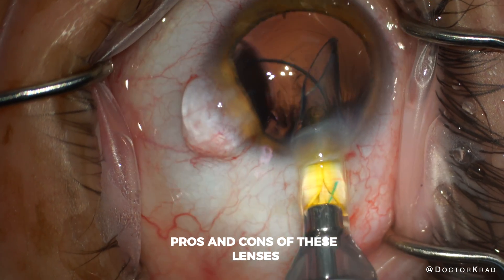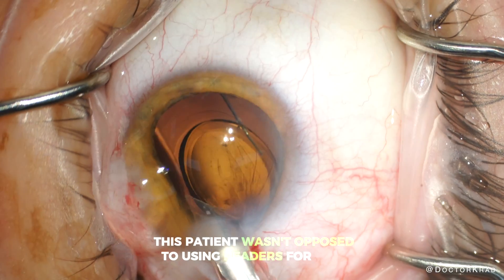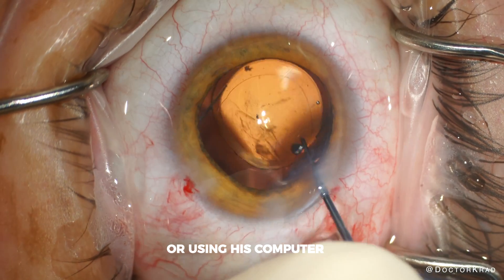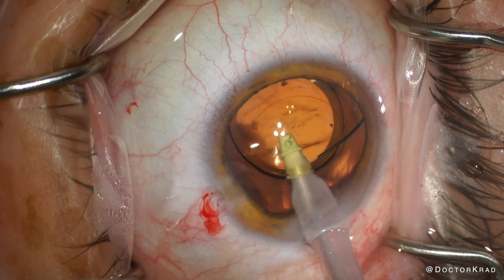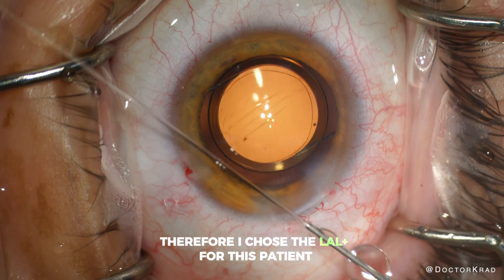Pros and cons of these lenses need to be discussed at length with patients before surgery. This patient wasn't opposed to using readers for near small print only, and mostly wanted freedom from glasses while driving or using his computer. So I didn't want to sacrifice the quality of vision in exchange for maximum range of vision. Therefore, I chose the LAL Plus for this patient.